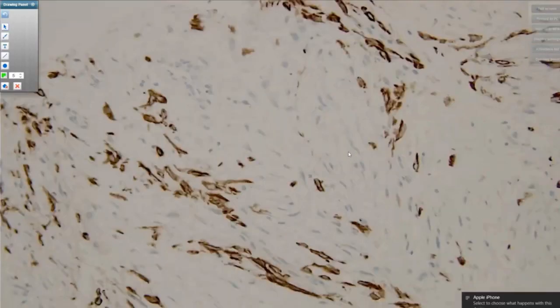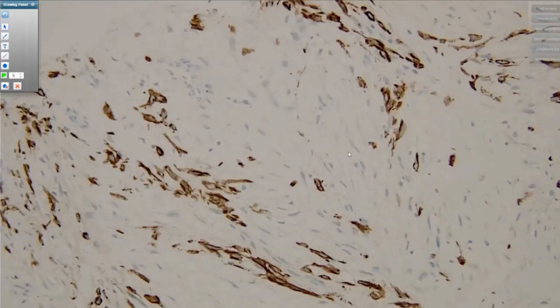I will note at this time that some metaplastic carcinomas, particularly the high-grade undifferentiated pleomorphic ones, don't label for any given single cytokeratin antibody, or sometimes they may not label for any cytokeratins because they're so undifferentiated. We always do a panel approach with our immunostains when evaluating for metaplastic carcinoma.